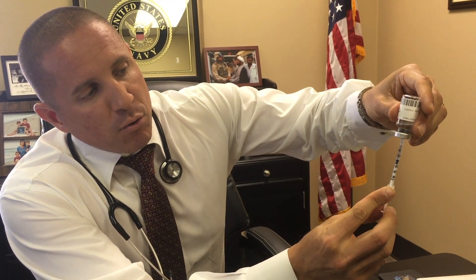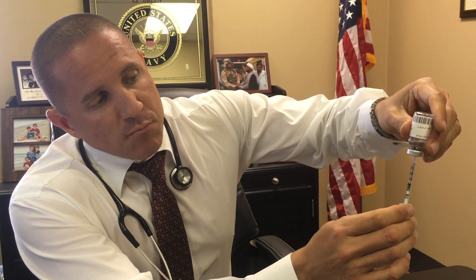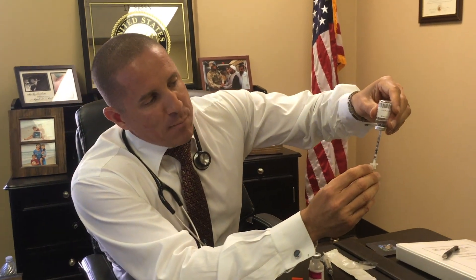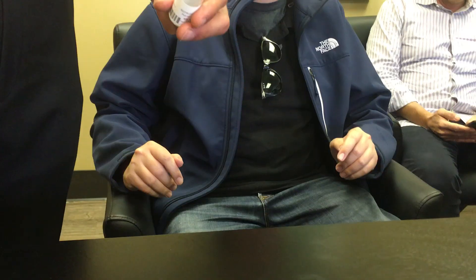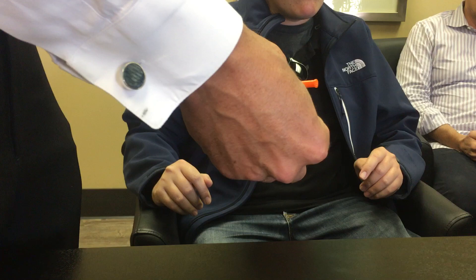If you pull to the 10 line, that's 250 units. Most of you are going to pull to the 20 line, which is 500 units. If you get a couple bubbles in there, just push back down to the 20 line, then pull out — you're ready to inject.